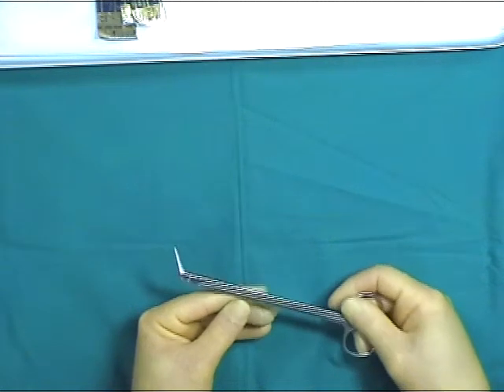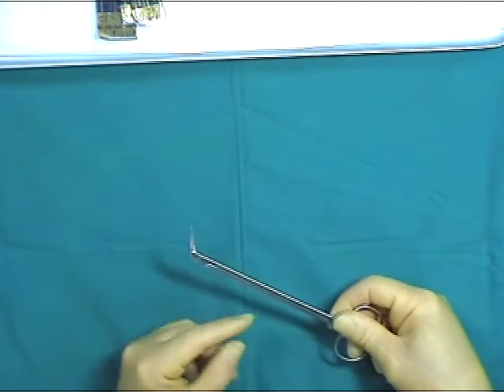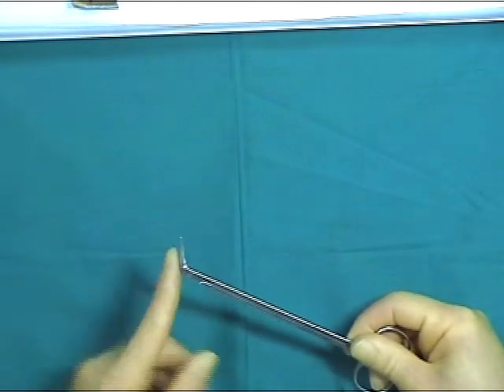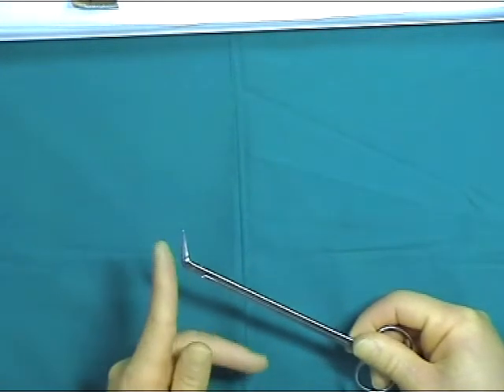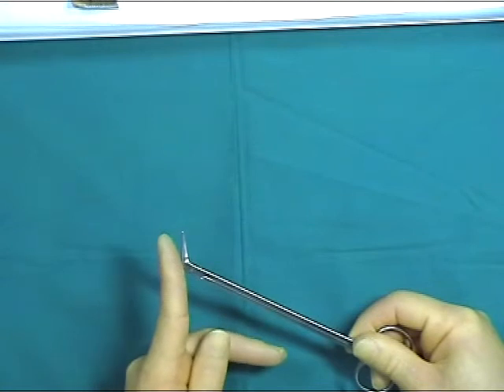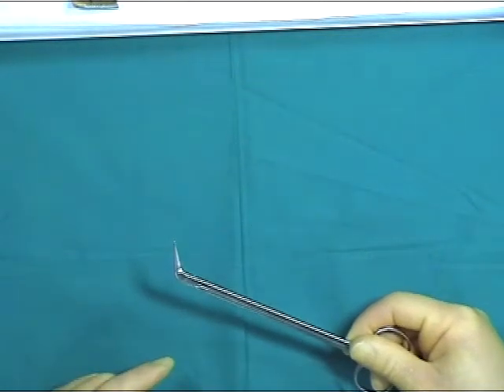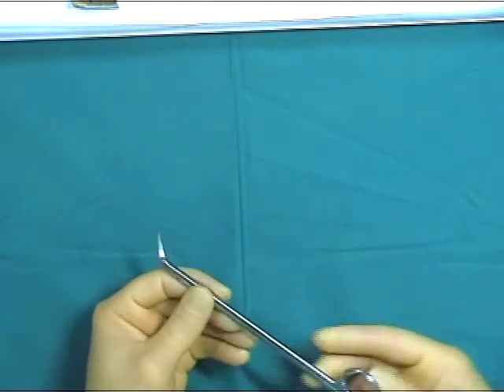POTS scissors are used in vascular work. You can see that the actual blades are at an angle to the shaft of the scissors. These scissors come with a variety of tips with angles ranging from 30 to 90 degrees and are useful for cutting straight along an arteriotomy.